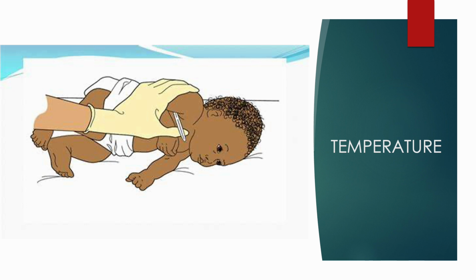This will determine, if you are using it axillary, how many minutes you should keep it under. If you are using it orally, how many minutes should you use it? And on any other way of using the thermometer, after how many minutes should you read your thermometer readings?